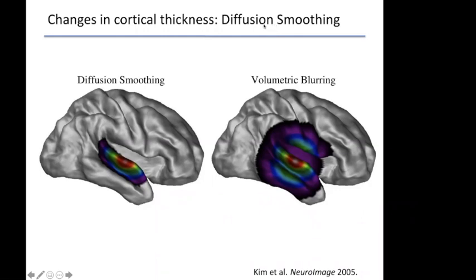But Colin, is there a difference between cortical thickness and volumetric analysis? Okay, there's a lot of questions here I missed. I'm going to go over them. When you say cortical thickness, is it the same as saying cortical gray matter thickness? It's not, it's a representation of the cortical gray matter thickness, correct? Based on what you see in your MRI data.